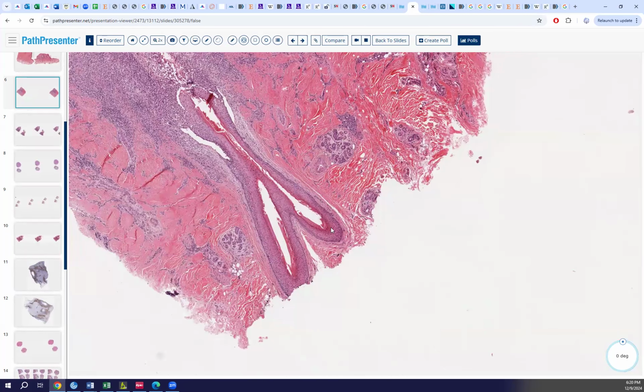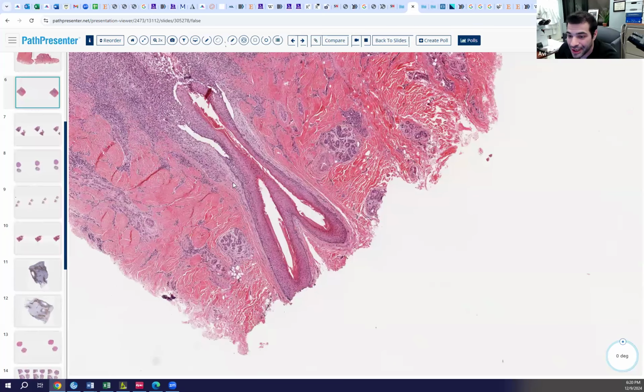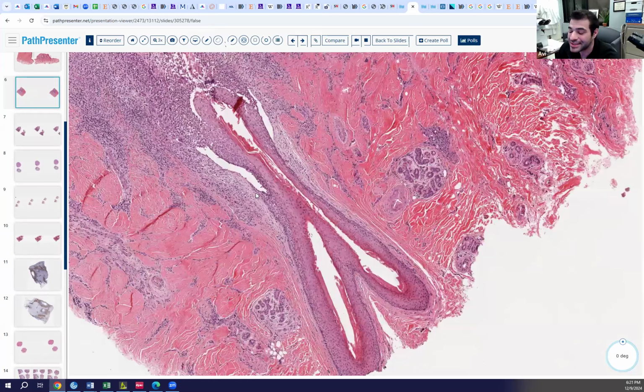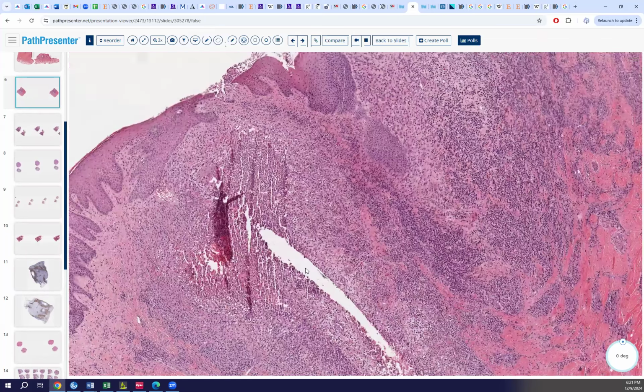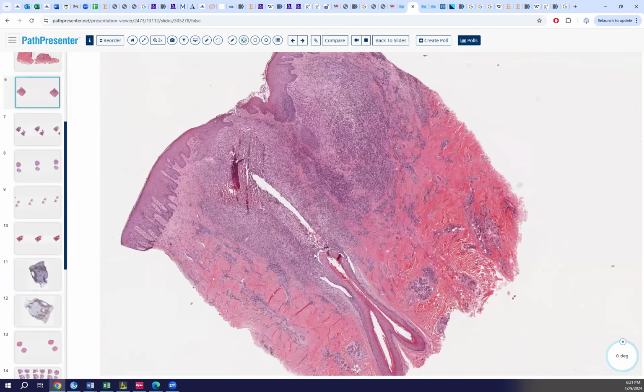Okay, and by the way, what else do we notice about this hair? Oh, there's like two hairs. Is this HS? There's like two follicles here, or two hairs going into one. Okay, so you have a double over here, but that's fine. Does that mean it's HS? No, I'm just thinking of the double-headed comedones that you would see in HS, I guess.